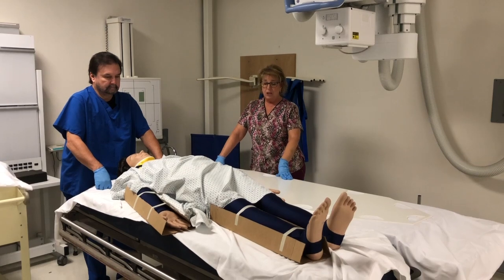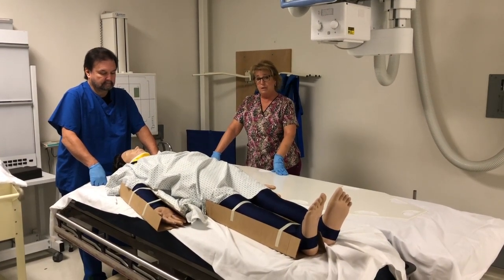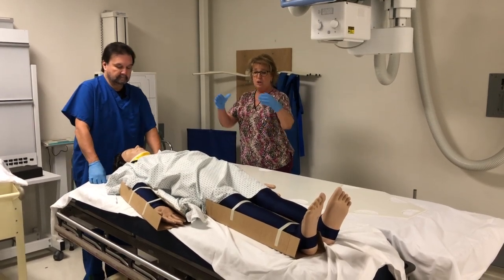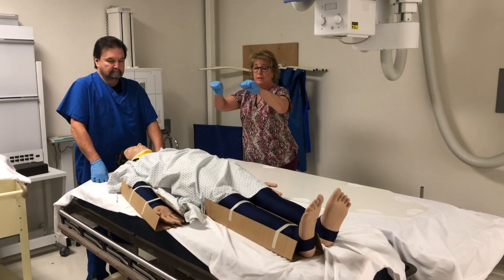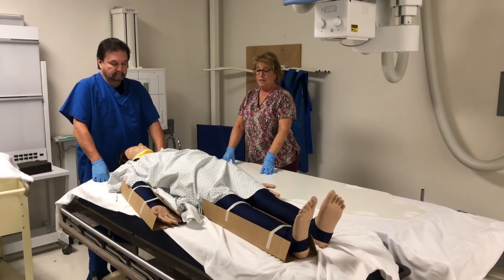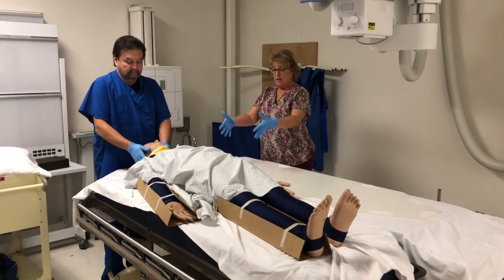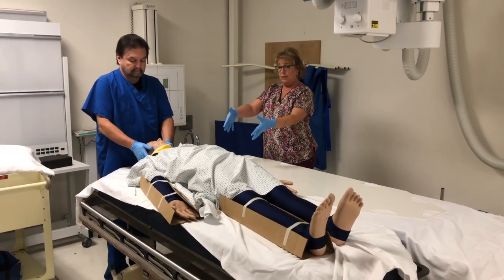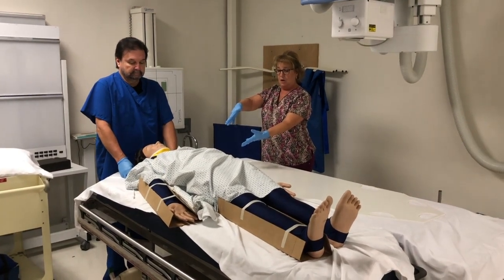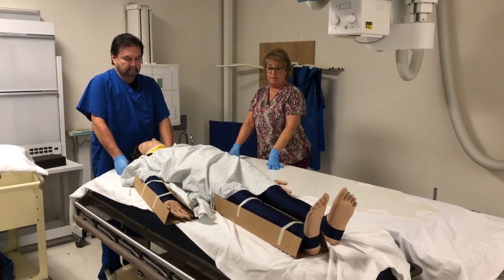So typically this would be at least a 3-person move, if not a 4-person move, because normally you would have 2 or 3 people rolling the patient to place the slider board under them, and then you would have another person at the head of the patient turning the head with the body rotation to make sure that the head always stays in alignment with the body, because we have not ruled out a neck fracture yet.